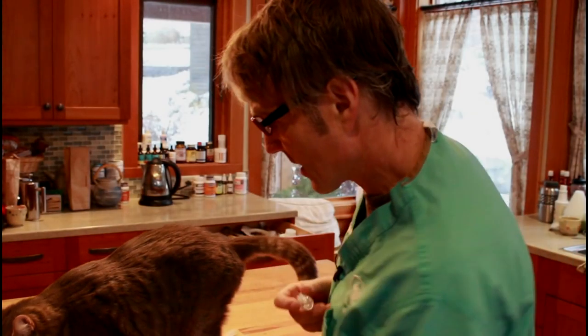When we're doing something like insulin in particular, I want you to take the bottle out of the fridge and warm it up in your hands. I always suggest pet owners roll it about 20 to 30 times first to make sure the insulin is fully mixed. This doesn't obviously apply to other medications — subcutaneous fluids are ready to go, and some vitamins you can inject directly. But if anything's been in the fridge, warming it up is a really nice idea, because it stings if it's cooler.